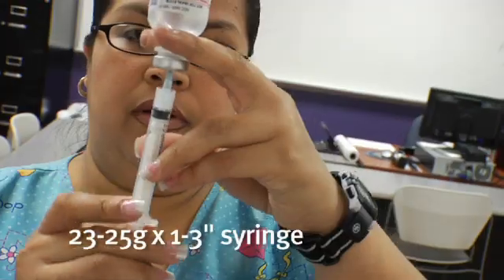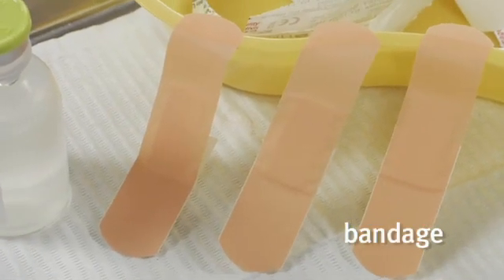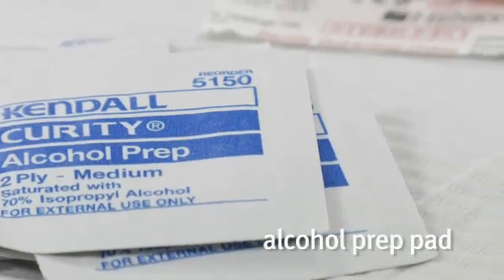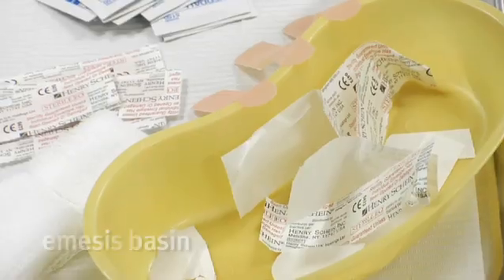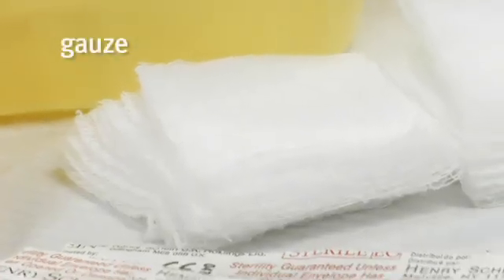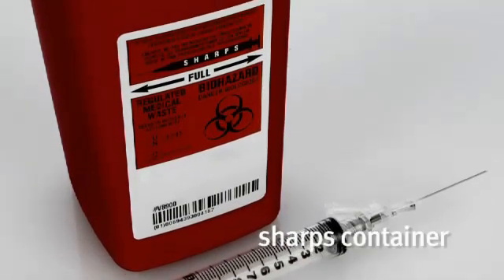You still use a 23 to 25 gauge syringe, anywhere from 1 to 3 inches. You'll need your bandage, alcohol prep, your medication — in this case we're using sterile water — an emesis basin for your trash, your gauze or cotton balls, your gloves, and of course your sharps container nearby.